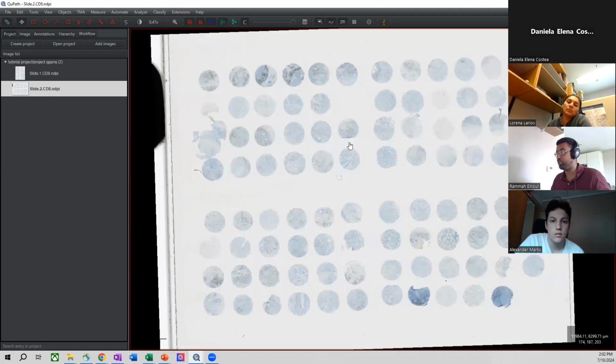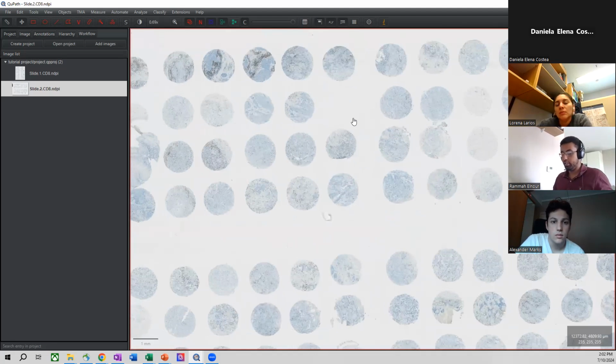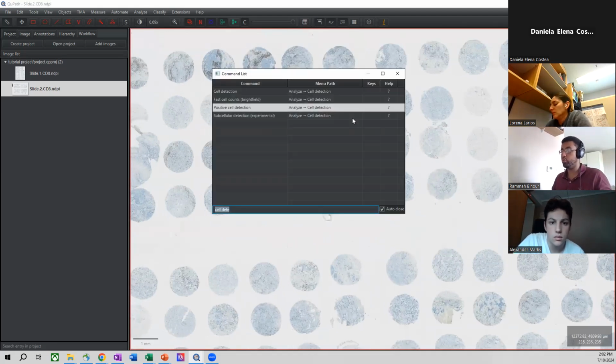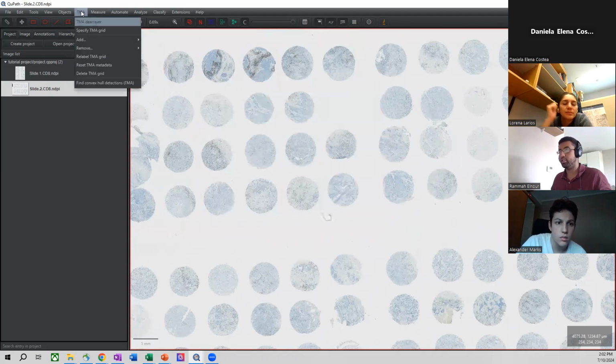But again, I haven't been able to do this perfectly, so it is something that you need to maybe play around with yourself. But the first step is to do something called the de-arrayer. So you click on the TMA tab over there, and then click on TMA de-arrayer.